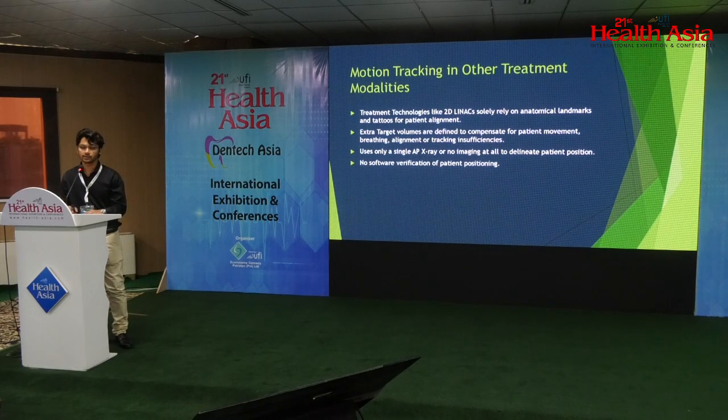Now, before I discuss the motion management in Cyberknife, I'd like to give an insight into how other modalities manage tumor motion. Like I said before, in 2D modalities, we completely rely on anatomical landmarks, anatomical positioning and tattooing. There is no X-ray imaging. So the physician and the medical physicist have to contour extra target volumes to compensate for patient movement, breathing movement, and any human error performed by the technologist while positioning.